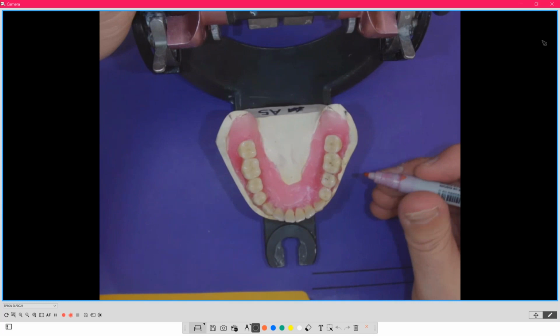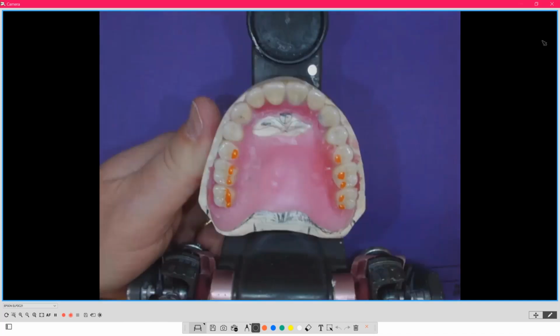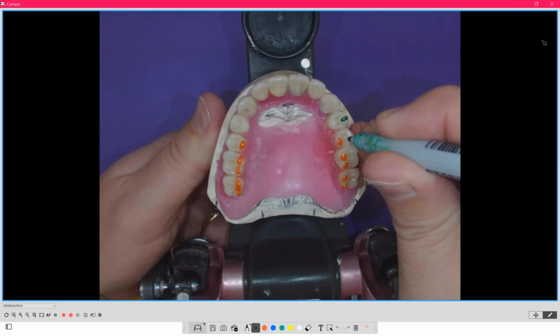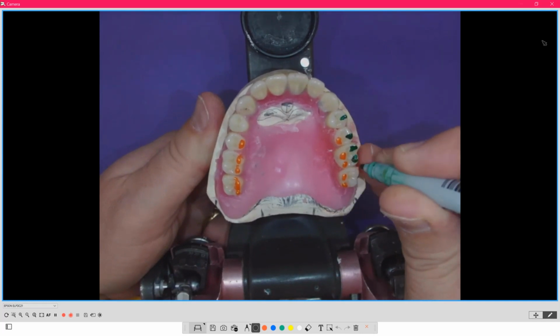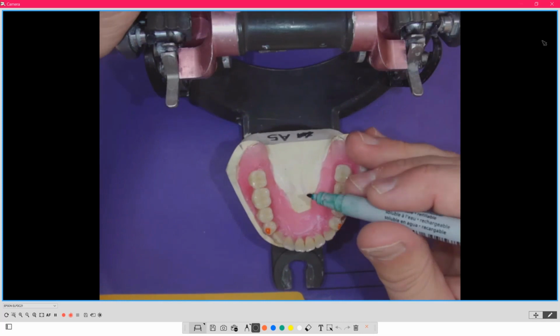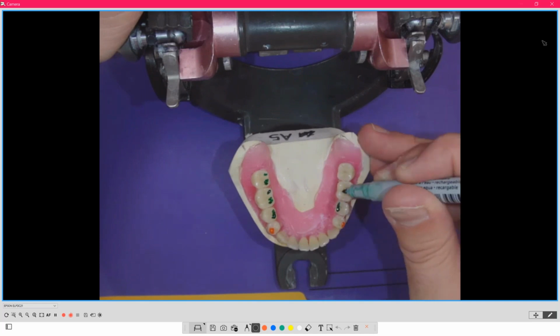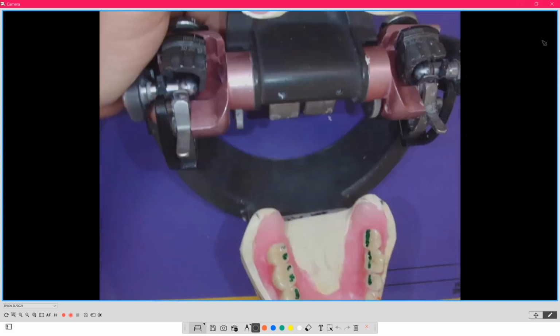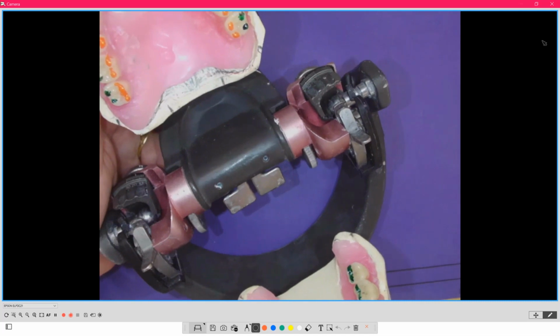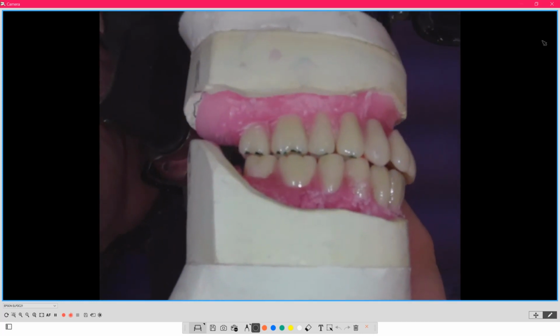For today's purposes, we're not going through a setup course, but I'm going to point it out. Now, remember, buccal upper, lingual lower. I coated this in green. This is freedom. I don't want any contact on these cusps. And the lingual of the lower, because this is where you get the hit and slide. When you hold the teeth together like this, you can see they are not knuckle tight. They have gapping in them. There's a little bit of space.